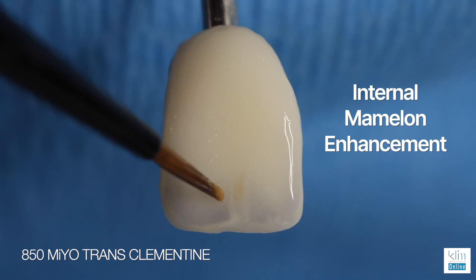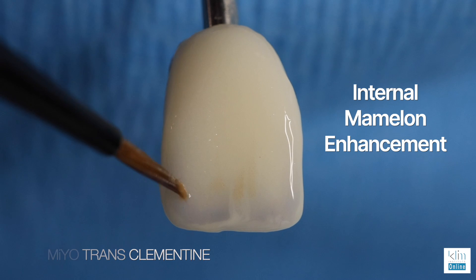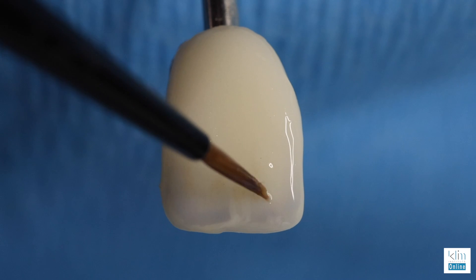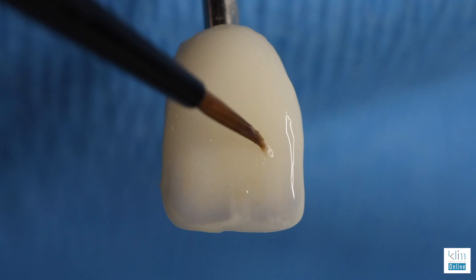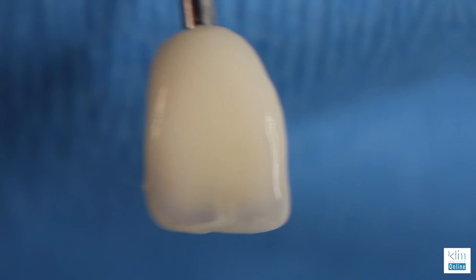Internal mamelon enhancement — this is fun to do. I like clementine; it's a nice neutral dentinal color. We can highlight the mamelon effect by adding some subtle colors around the high value where it creates more of a separation for that incisal mamelon internal look, and it's pretty cool.